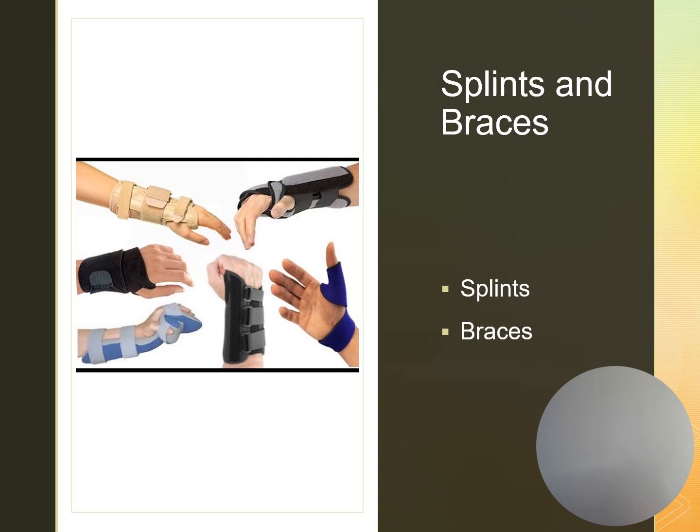Braces are going to provide support. They also control movement and help prevent additional injury. Make sure that you provide client and family education on when it should be worn, how it should be placed, etc. Braces can be made of plastic, canvas, leather, or metal, and they can be custom fit to the client.